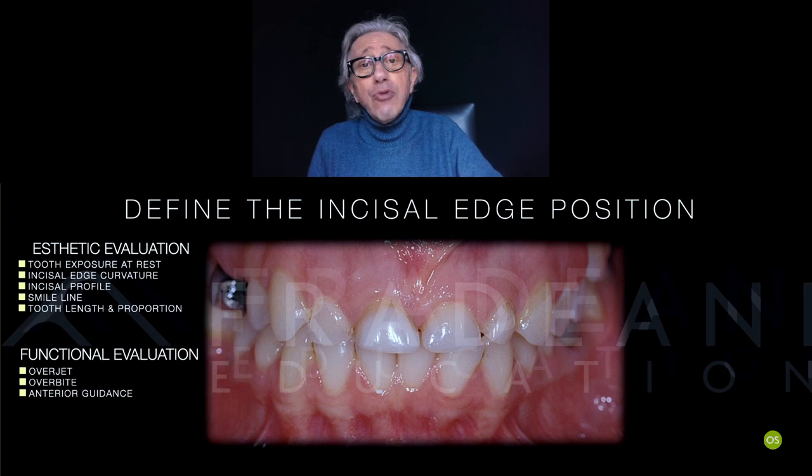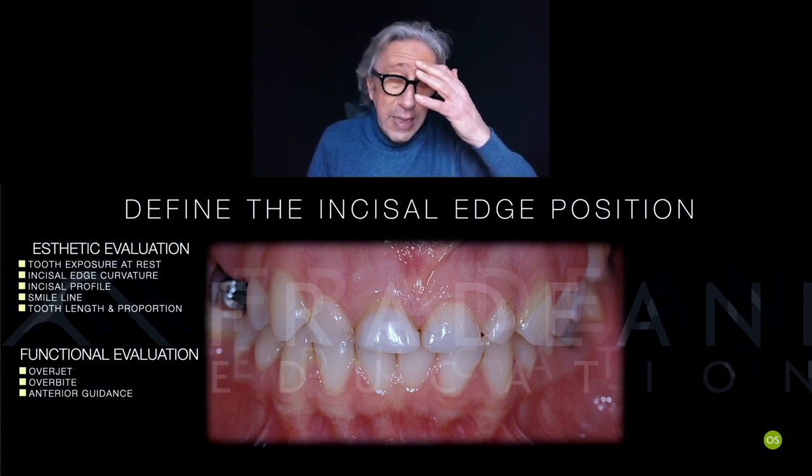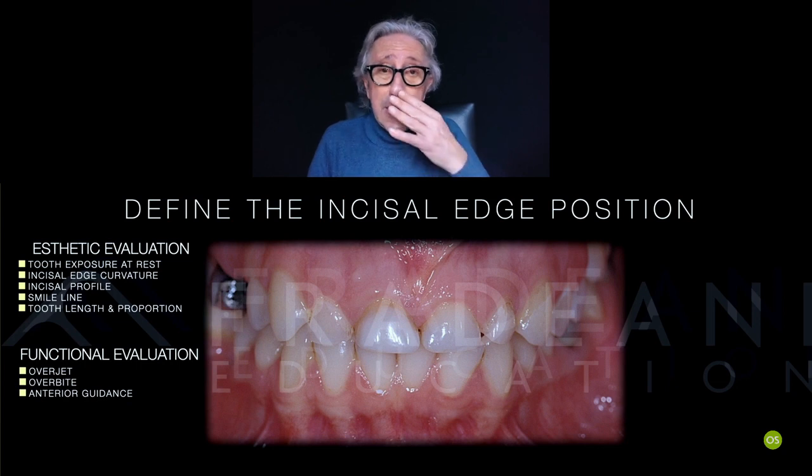But then you have to test it on the patient's mouth. Let them move the mandible in front and laterally, and you can understand. Sometimes you move right and left very easily, but other times you do not move the mandible so easily. So you have to touch the occlusion a little bit until you have the best fluidity of the incisal edge, the anterior guidance, cuspid and incisal guidance. That's very, very important to obtain this result.